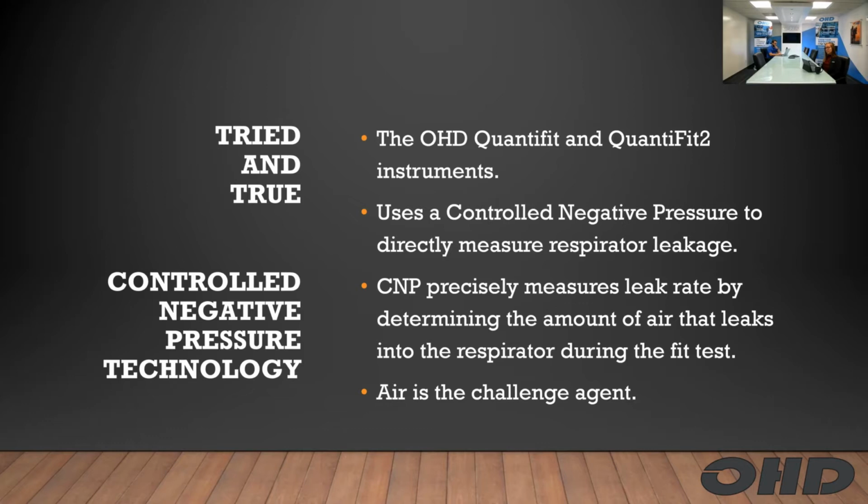We use air to challenge the respirator, and the QuantiFit uses air molecules that have an ambient concentration in the septillions. So simply put, when we're creating and maintaining a controlled negative pressure that's mimicking the inhale of an average human working at a moderate rate, we're creating an environment within that respirator that's going to have all those air molecules just fighting to get in any way possible.